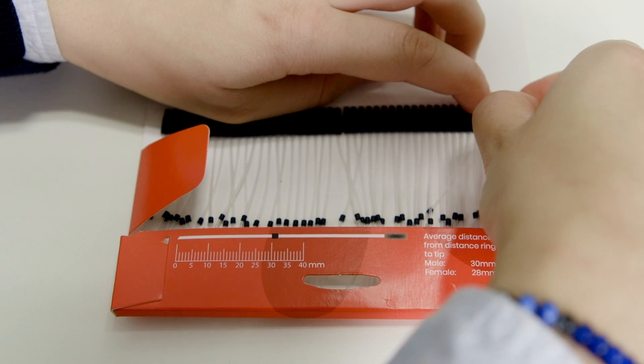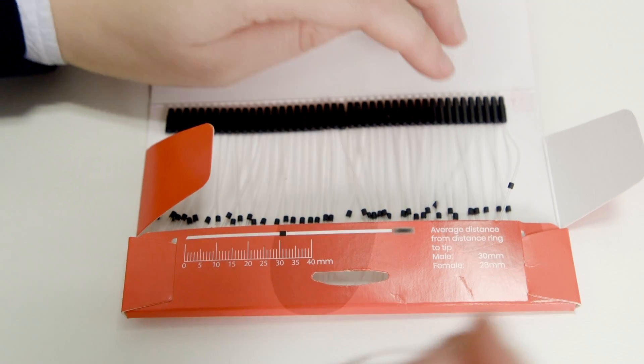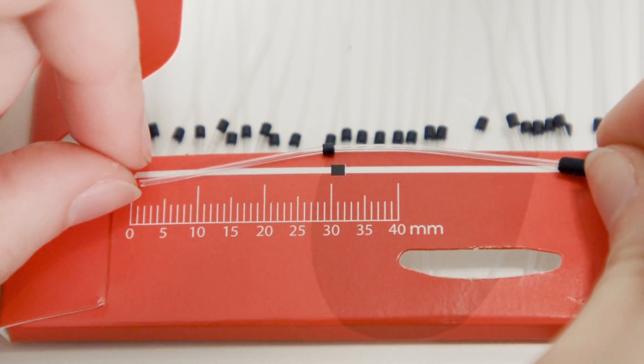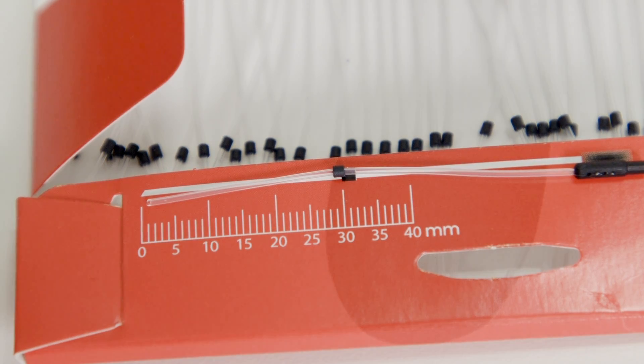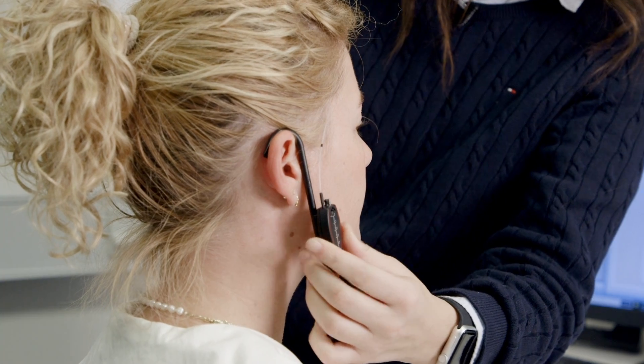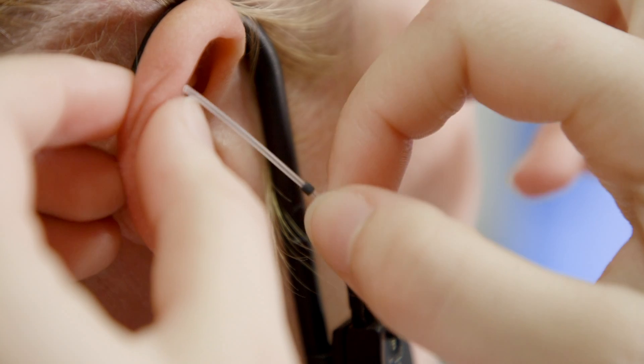The probe tubes are typically manufactured with the black marker placed at 30 millimeters. Slide the marker to the desired length, and you can now insert the probe tube until the black marker rests at the inter-tragal notch.